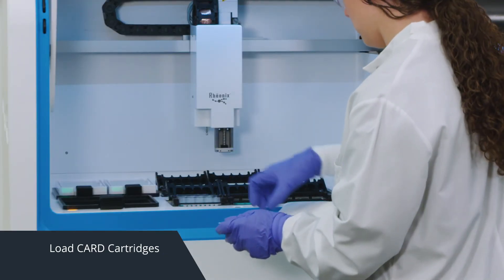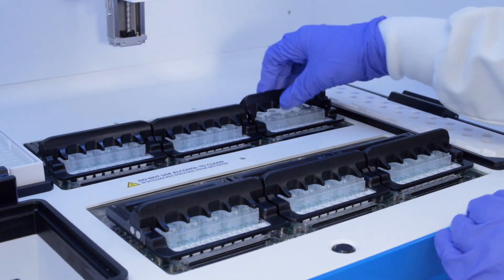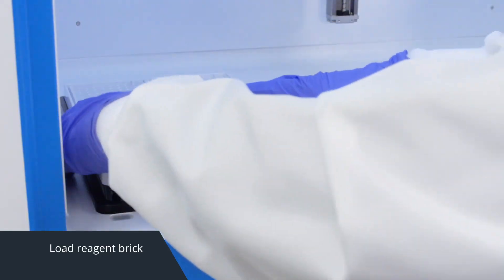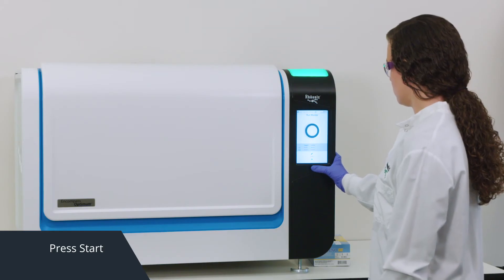Load the sample rack onto the workstation. Load three or six card cartridges into the modules. Each cartridge processes up to four samples. Load the reagent brick and close the door. The workstation will do a short pre-run check to ensure components are properly loaded.